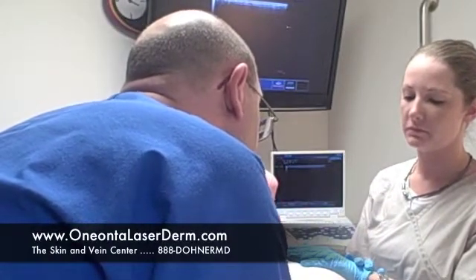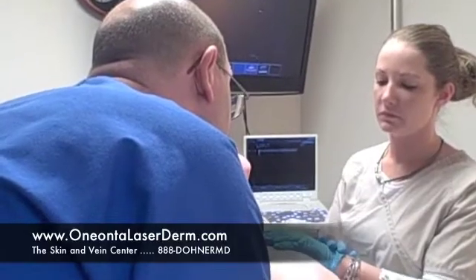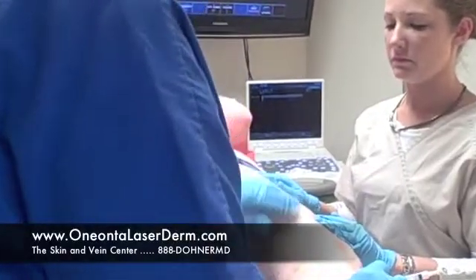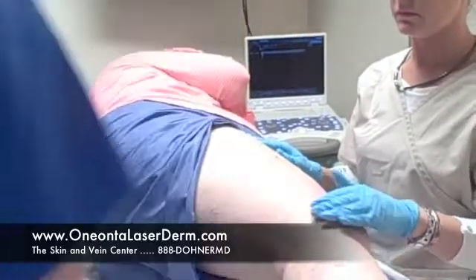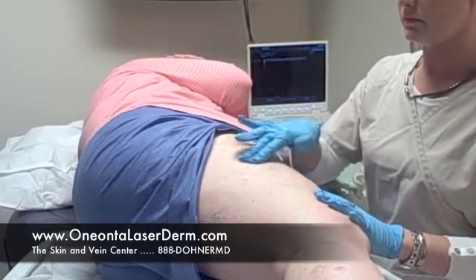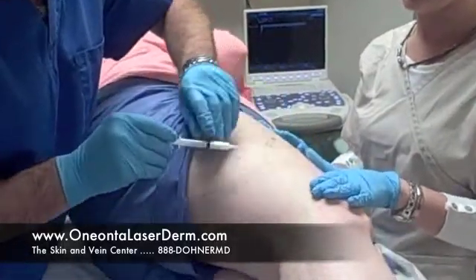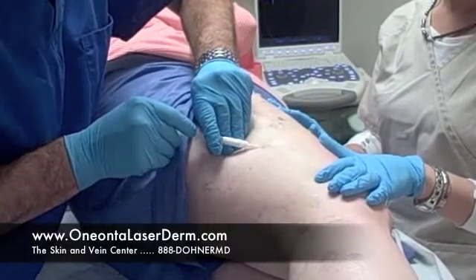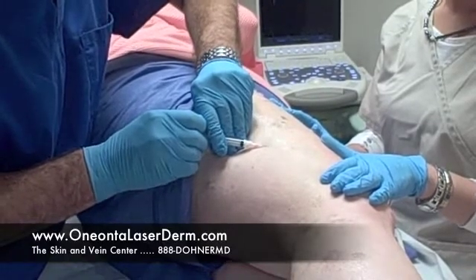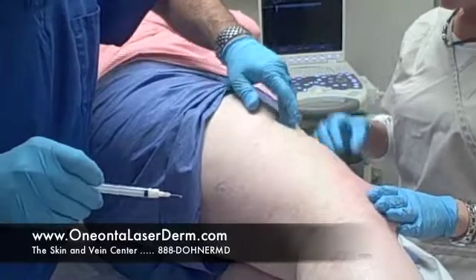Let's see if I can get into this vein. Got a nice flash. It's going up the vein. That looks pretty big, so I'm going to do another injection there. You can see how quick and easy and painless this is. I'm just massaging that medication all along that vein.